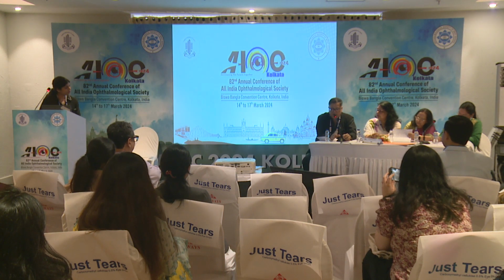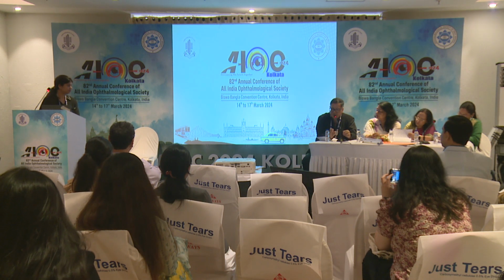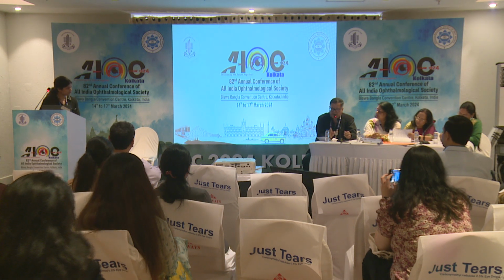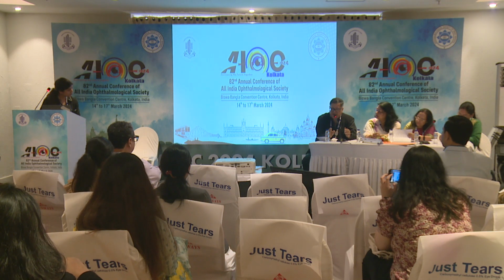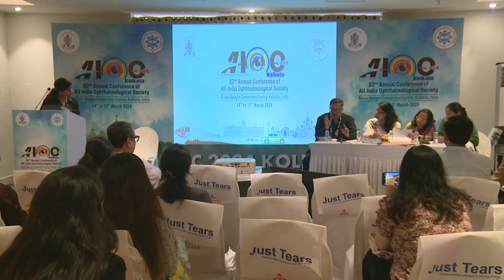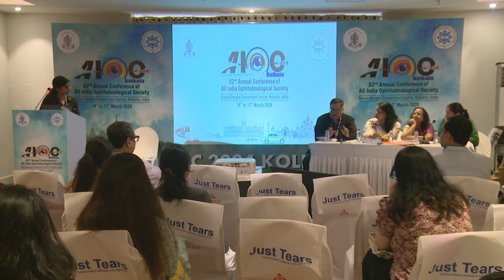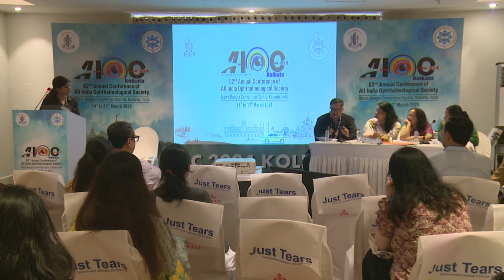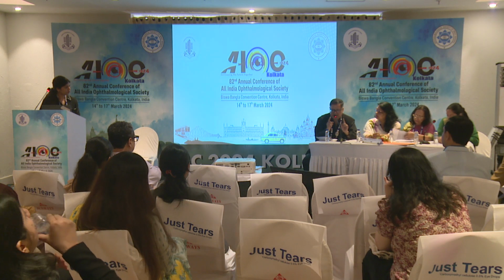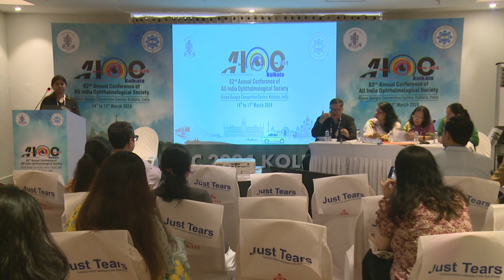Anyway, have you quantified your incisional size? Sir, it was 2.8 mm and it was biplanar, sir. Have you quantified the incision planning, because according to the preoperative astigmatism you have found, it has a very important role. You cannot make only a standardized incision for all grades of astigmatism.